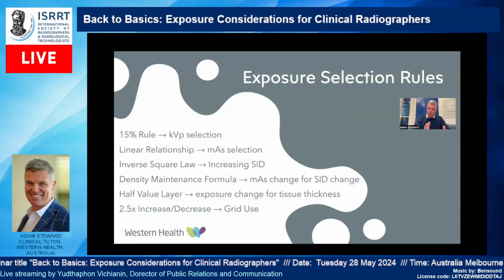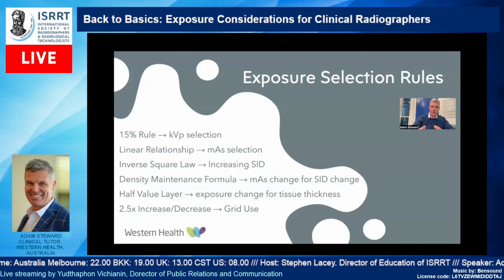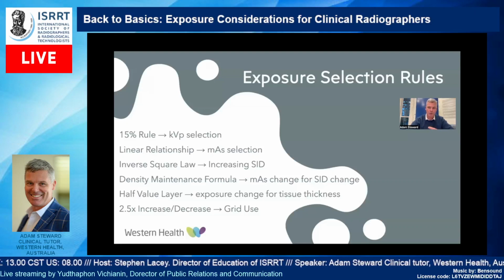So again, a lot of these rules will work. Hopefully they can help you in your clinical environment. I hope that they will. Use them with a grain of salt, but it's really important that you utilise them in conjunction with understanding them and understanding your system. It's really important you understand the DI or EI or the set ranges of your system, so that when you're manipulating things, you're capable of providing images that have great image quality, but are also maintaining an optimal dose, as low a dose as you can achieve.